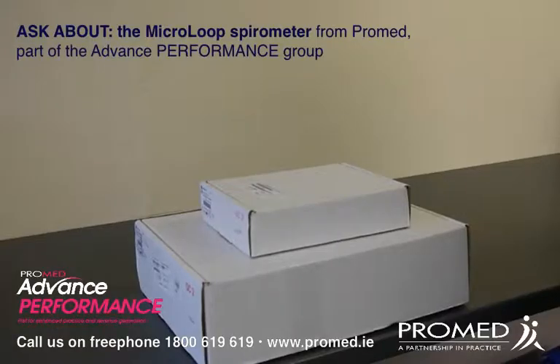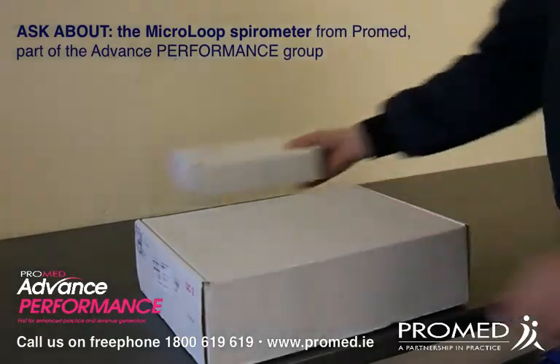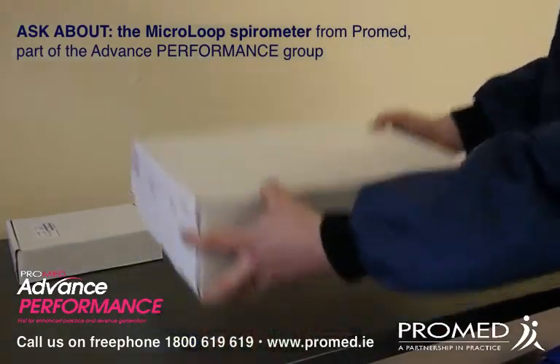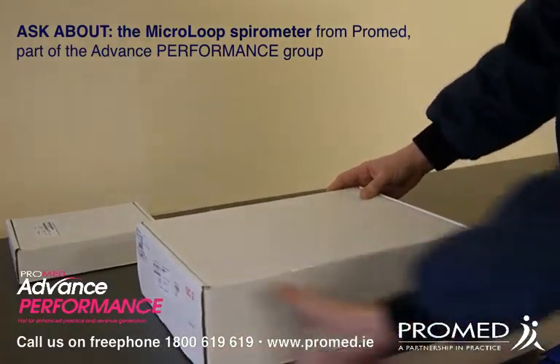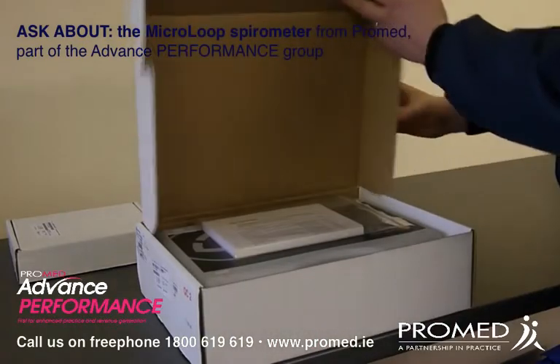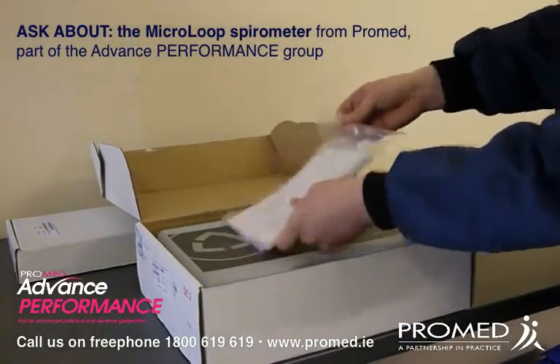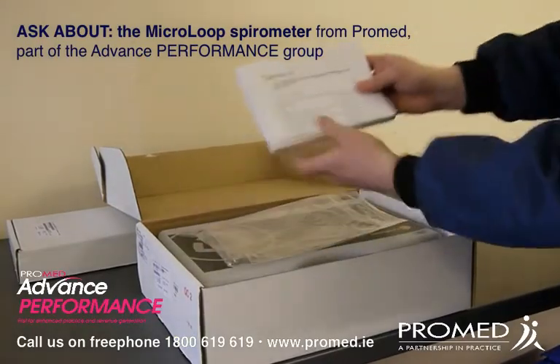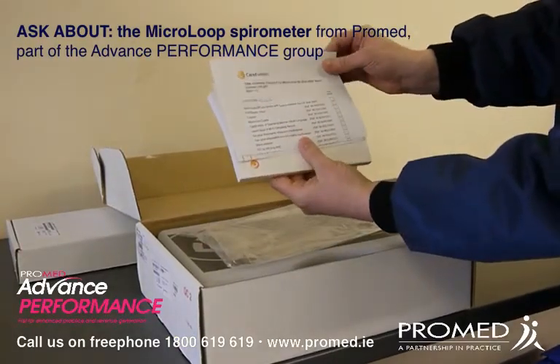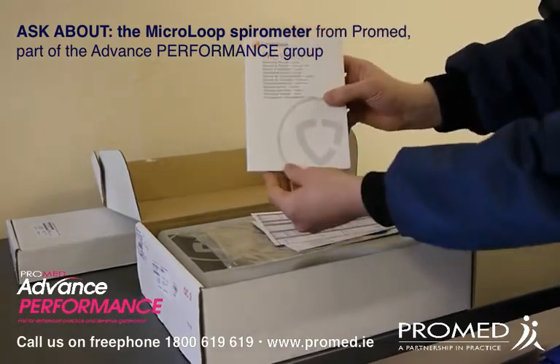If we now show the items as they would come to yourselves and the customer, you have the software package and you have the equipment package. And if we now open up the equipment side, you can see contained within is a bag of the items that come with it. You see your contents checklist, your calibration cert, and your user manual for your item.